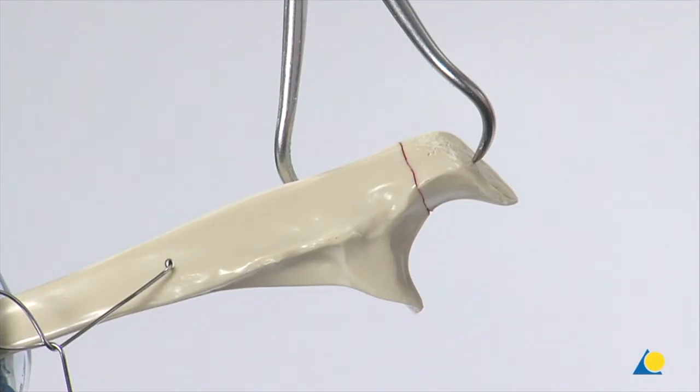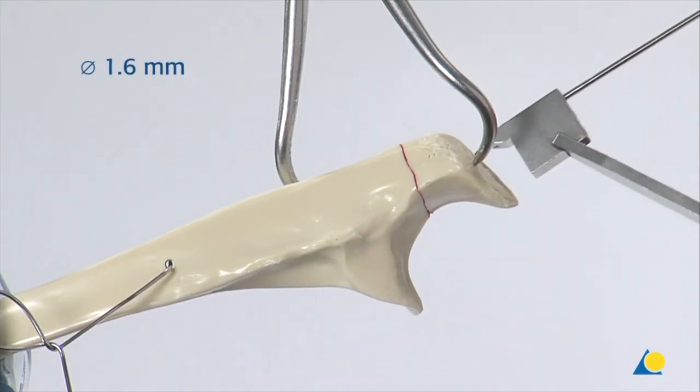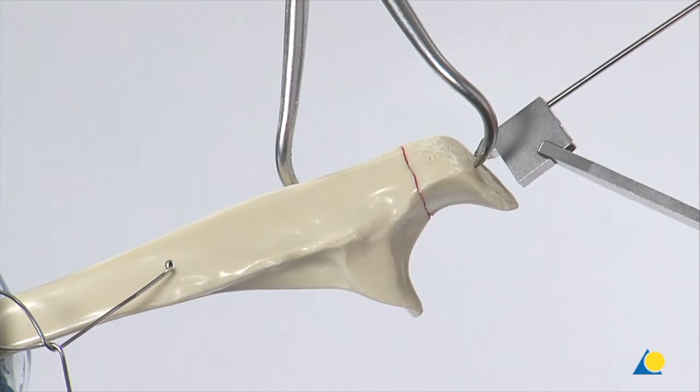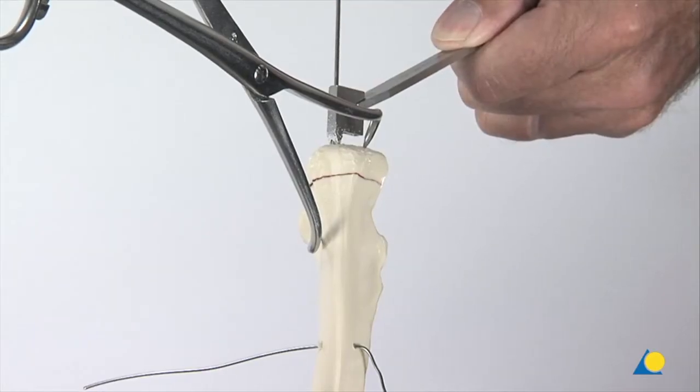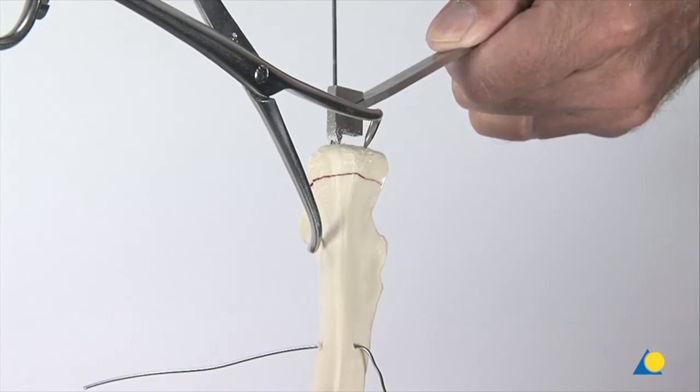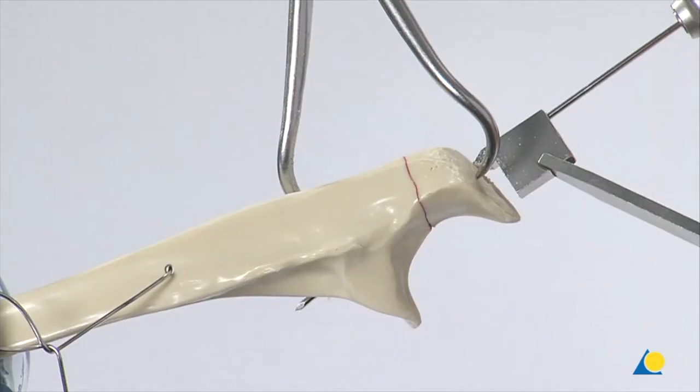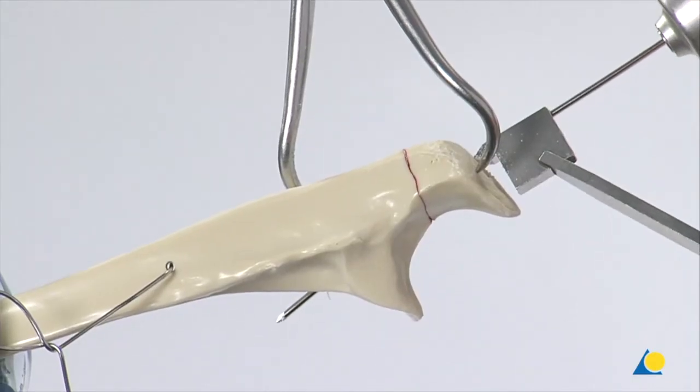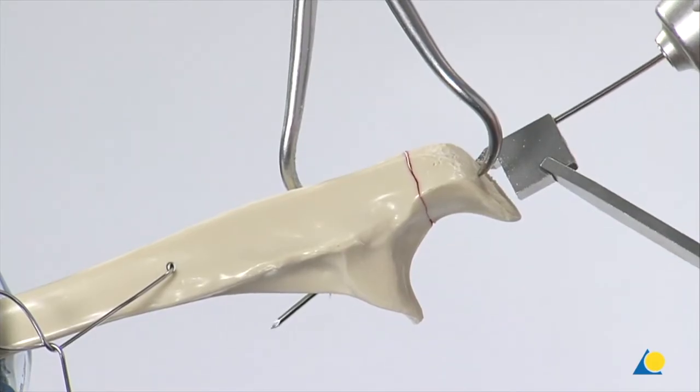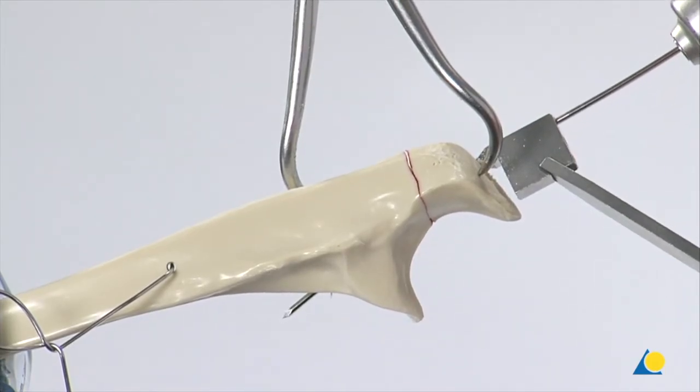Using the triple end of the 2.0 drill guide, the first 1.6mm K-wire is inserted through the point of the olecranon parallel to the shaft of the ulna and as close as possible to the joint. After the anterior cortex has been perforated, the K-wire is retracted approximately 1cm.